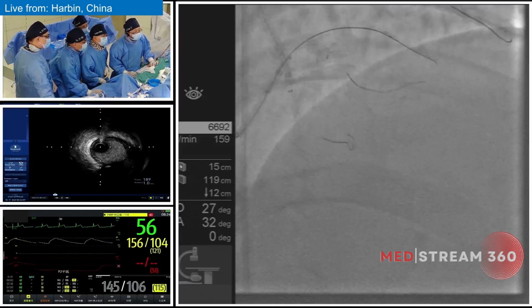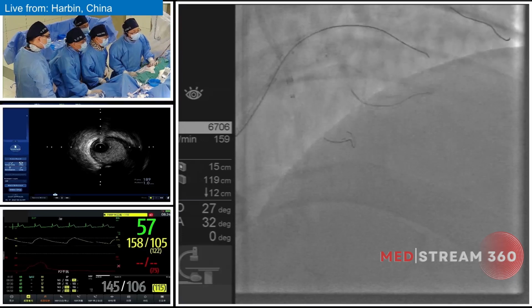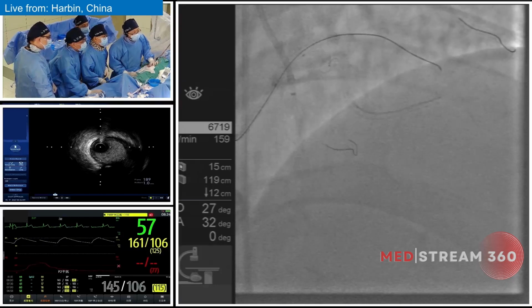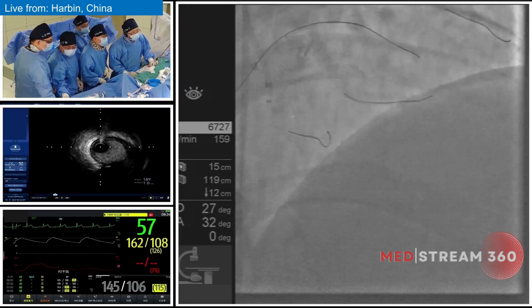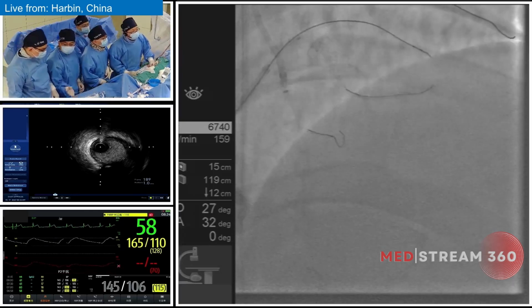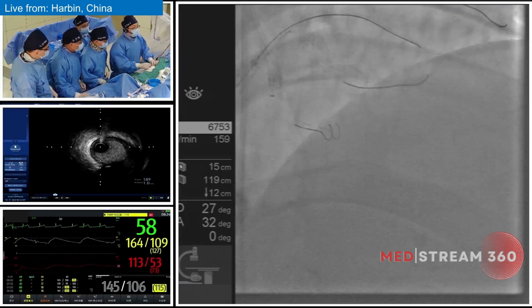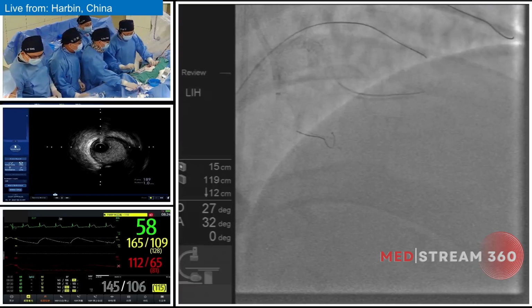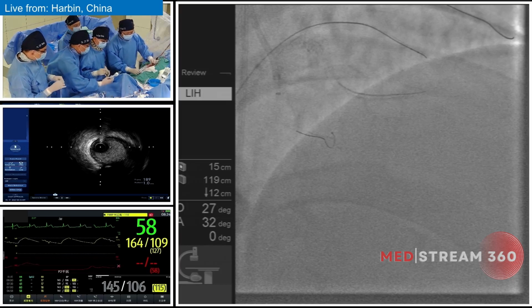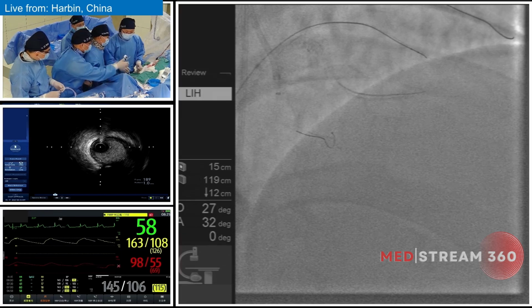And the second thing is that we can see the antegrade knuckling technique successfully goes to the distal part of the occluded segment, next to the distal cap. And why do we not try to use a cross-ball catheter to engage the distal part of the CTO segment? There are several things. First, I think knuckle wire can relatively cause less damage compared to the Crossboss. And also in this kind of calcification case, I think it's relatively easy to engage the distal cap of the CTO segment.